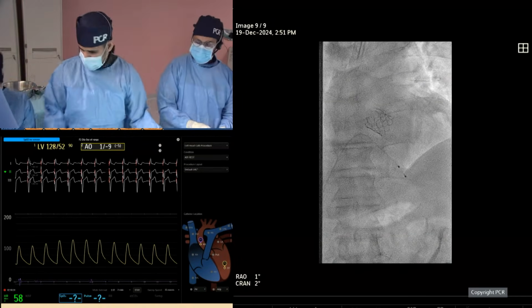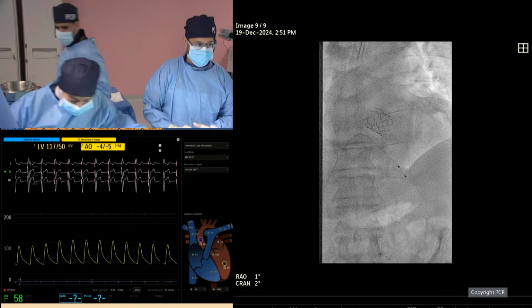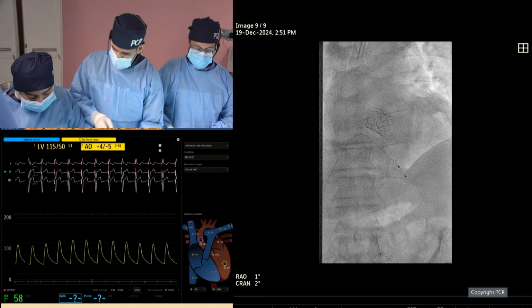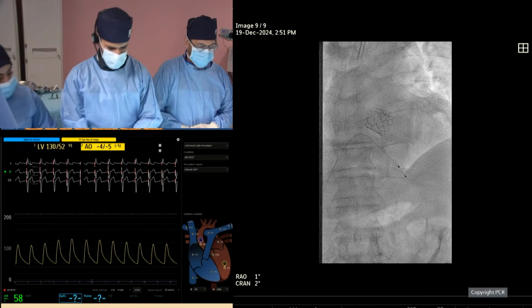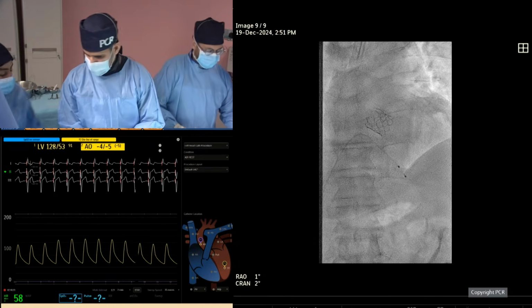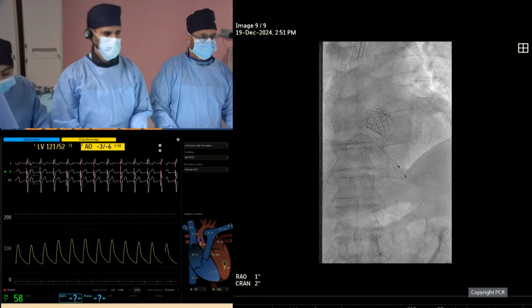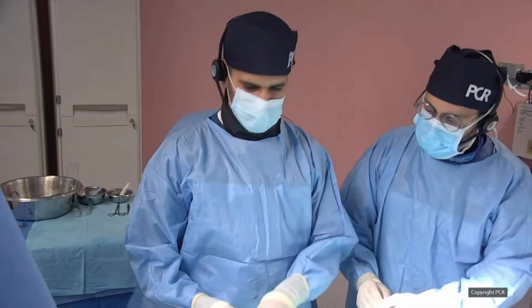So I think that was a great case, great live demonstration. We would let you go off the screen and continue our session, because we know that you've got to shift over for the next live case, and we want to give you time for that. So please go ahead. I think you've done a great job. Thank you, everyone. Let's put the wire through.